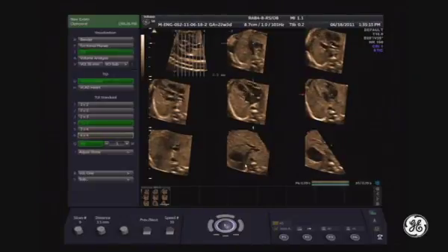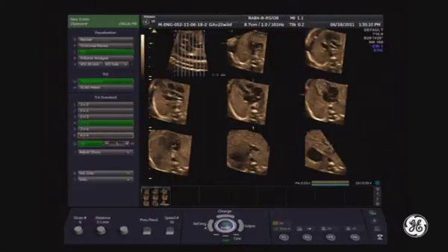And you remember our discussion. We are navigating through the cardiac views in axial sections, and here you can see them on the same screen. Upper abdomen, 4-chamber, aortic root, the 3-vessel view. You can select the distance between the slices, and you can move the set of the slices together.